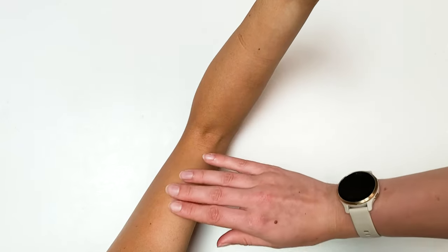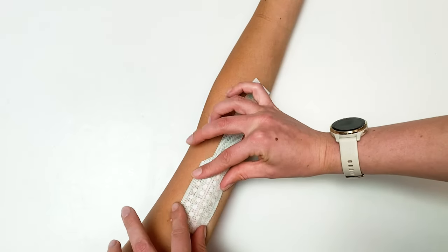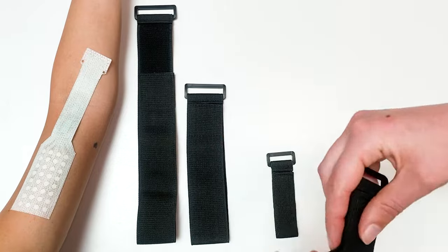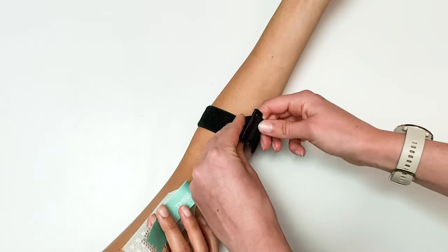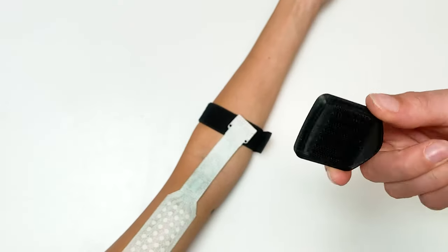Locate the muscle you would like to measure and make sure the skin is shaved and prepped. Place the grid straight over the desired area and press the grid down with your hand. Choose one of the four cradle straps that fits the location of your participant best. These straps are designed to secure the adapter cable during measurement to prevent movement artifact.